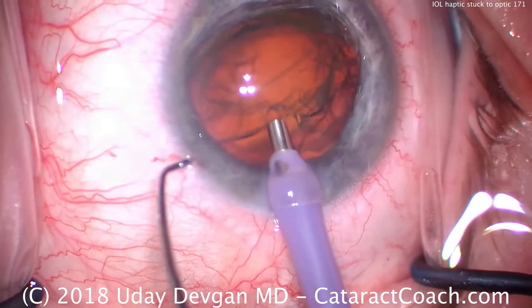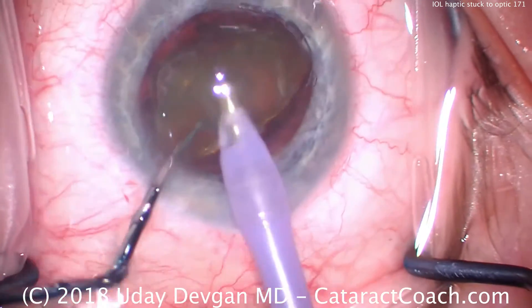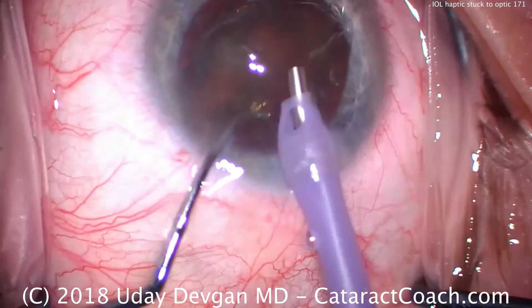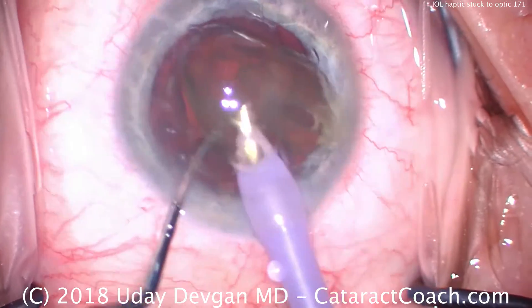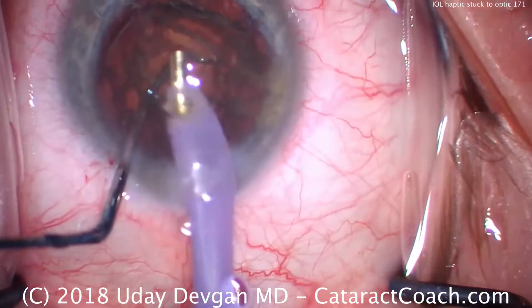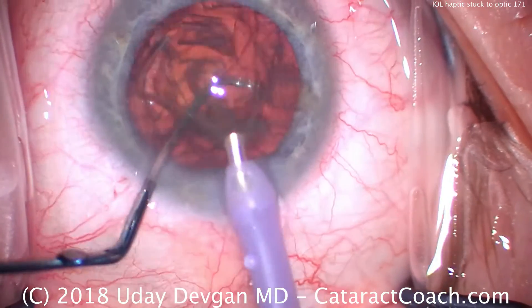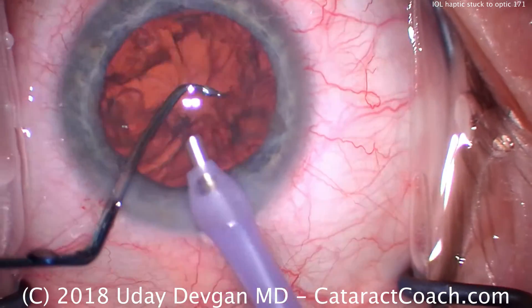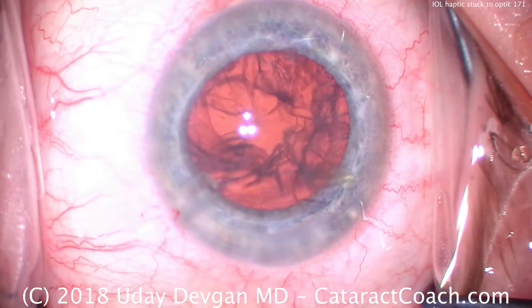Now for the phaco probe — high flow, high vacuum mode, buzzing in the center of the nucleus, chopping it. We have two halves. The first half can be emulsified relatively quickly. I'm using a high flow rate of 50 or 60 cc's a minute, so things happen relatively quickly here. The second half of the nucleus is brought up as well, and all we have to do is keep it occluded on the phaco tip. The high vacuum level, high flow, and phaco power modulations will allow us to quickly remove it. The nucleus is out of the eye just like that.